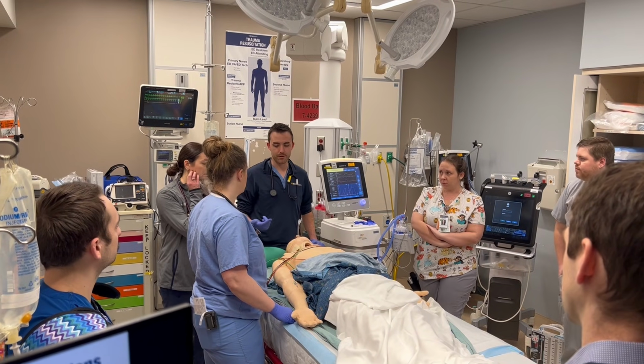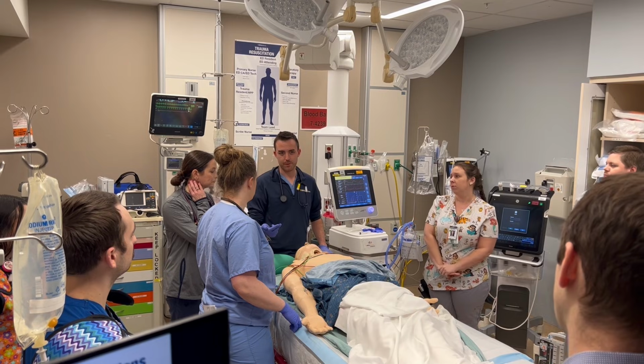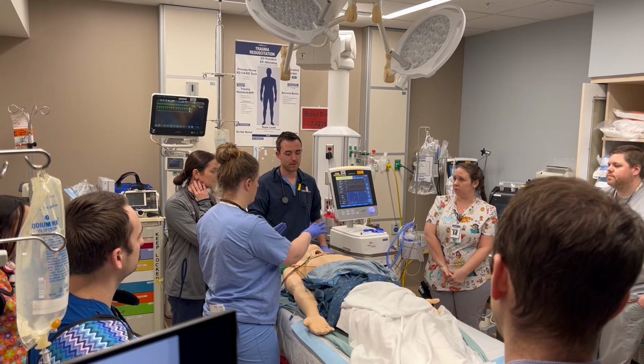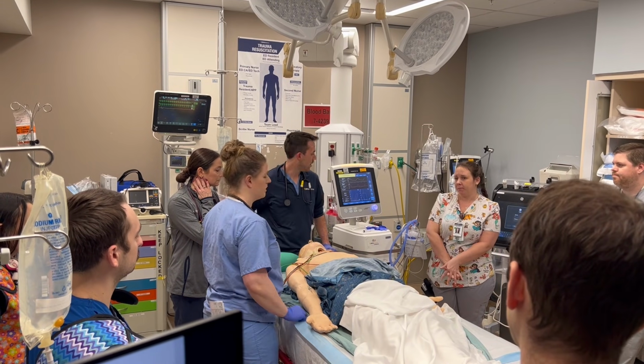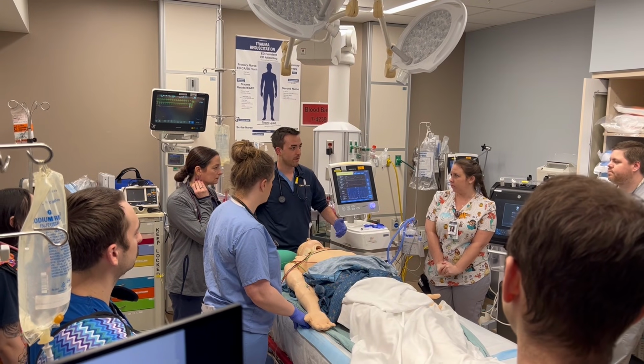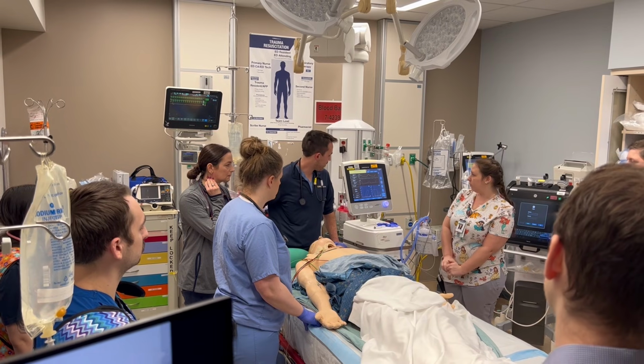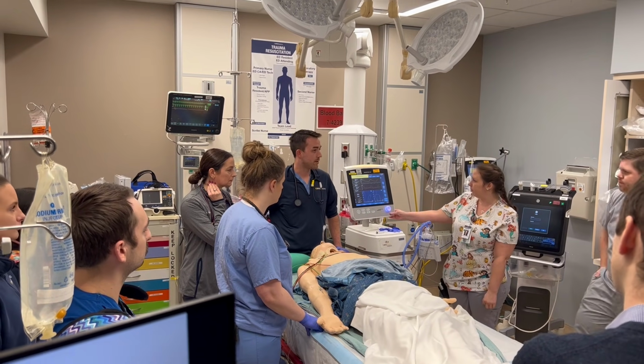Worsening pulmonary contusions, worsening hypoxia on the vent. Our tube is in the right place, we have no pneumothoraces. We've checked the vent. We could increase some of our positive pressure, see if that improves our oxygenation, increase our PEEP as much as we're allowed to.